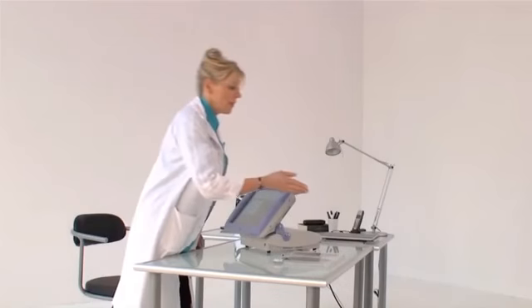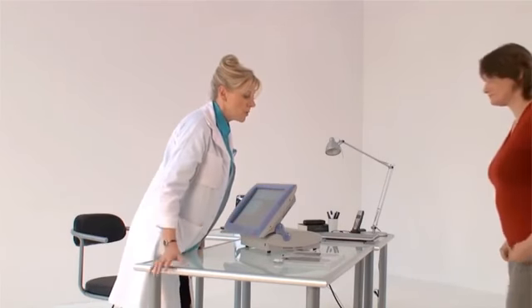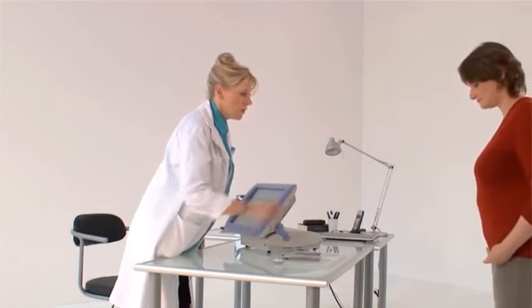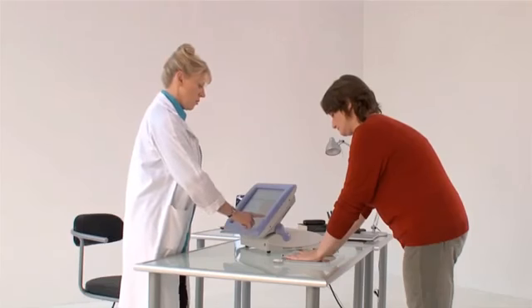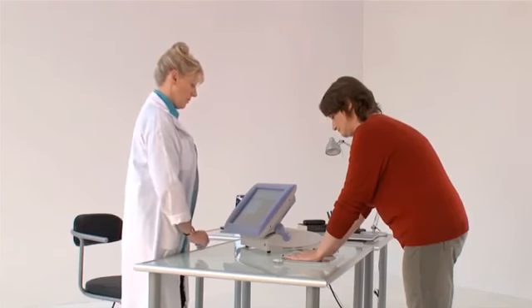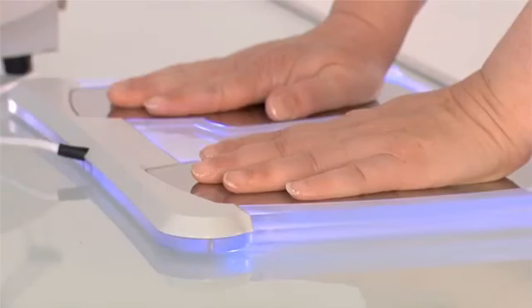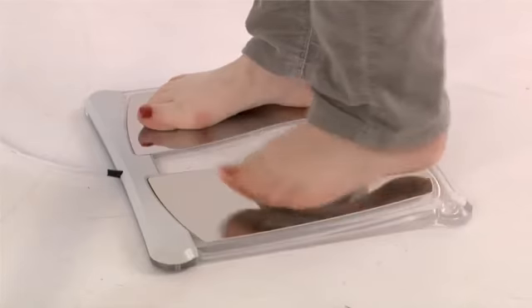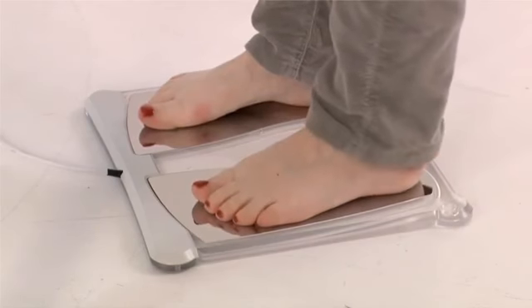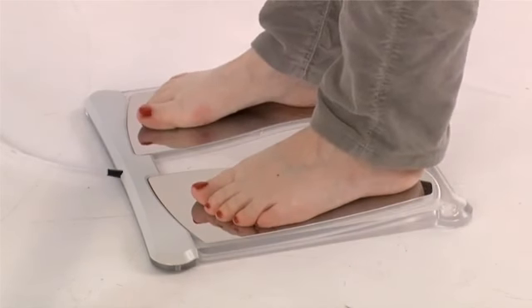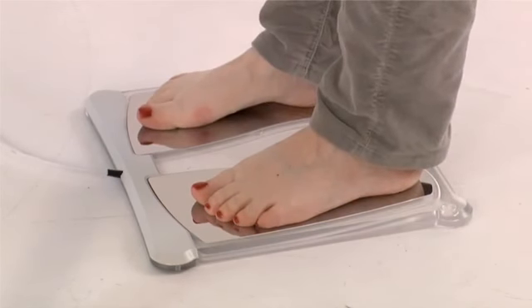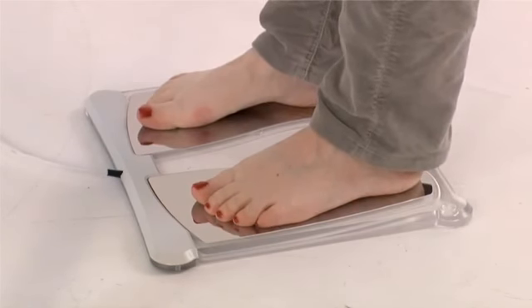The patient is asked to put his hands and feet on the stainless steel sensor plates. They must be centered on the plate for maximum skin-to-electrode contact. Movement must be avoided, and the patient must not be touched during the scan.